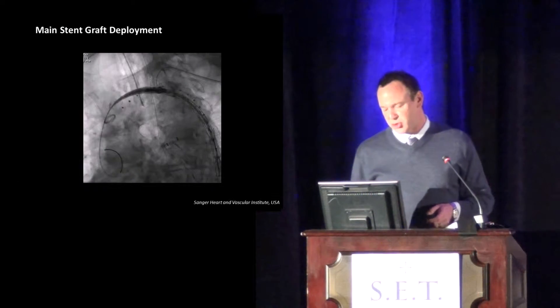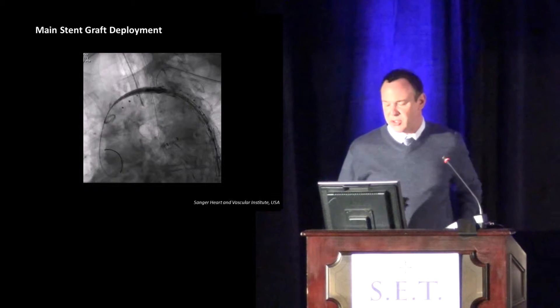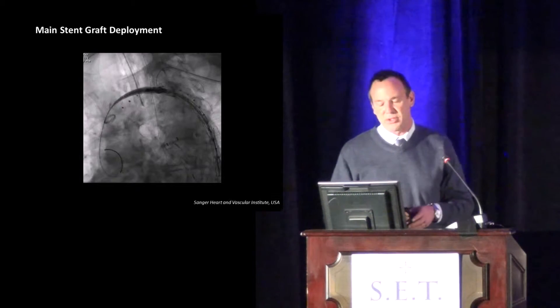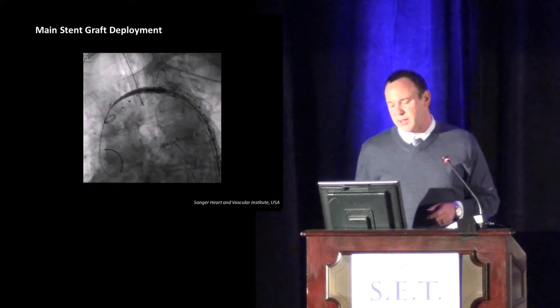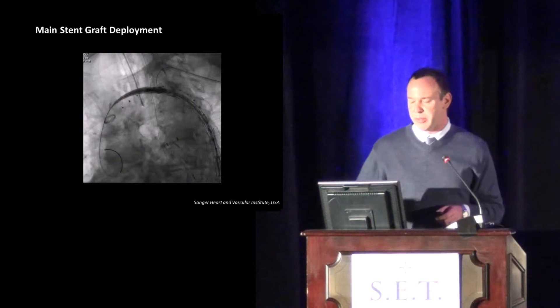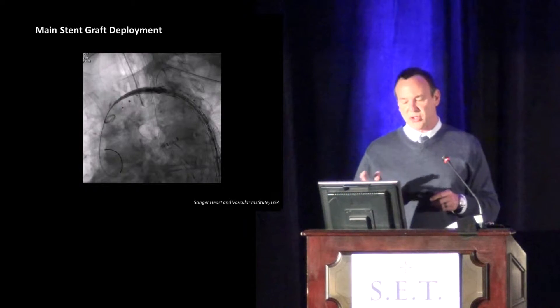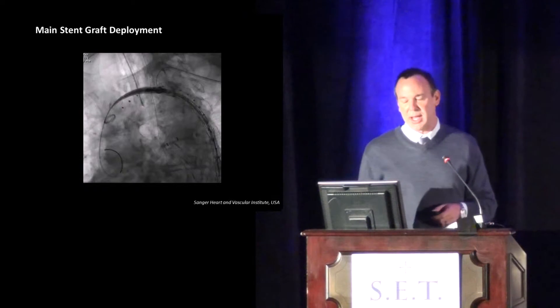Some of the keys here: you can see there's a very nice separation of the main graft and that wire, and once you have that separation, you really know that your alignment is good. We will typically get these into a steep LAO, and then also take a view right down the main trunk of the arch — typically an RAO with a little bit of caudal direction — so we can see that secondary wire going straight up in the left subclavian. With this device, we tend to keep it distal to the left subclavian, and as we deploy and pull on that wire, the device slowly moves over because it's captured in the tip and aligns itself very nicely.